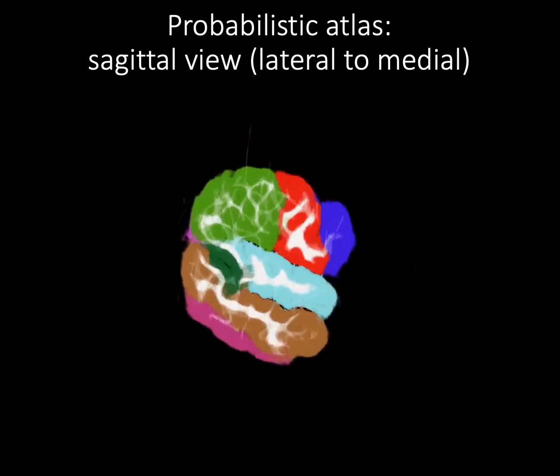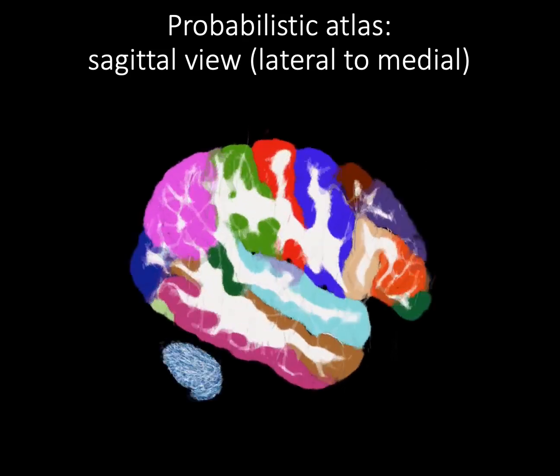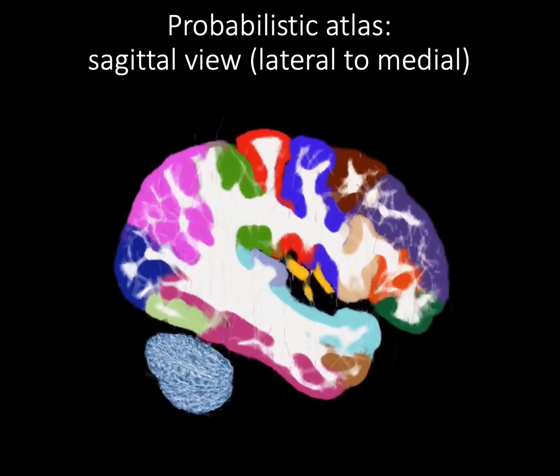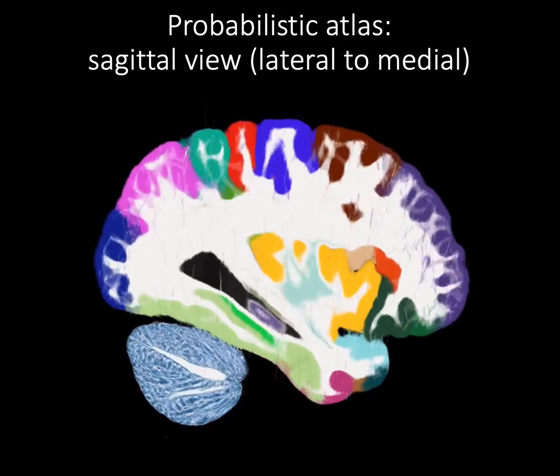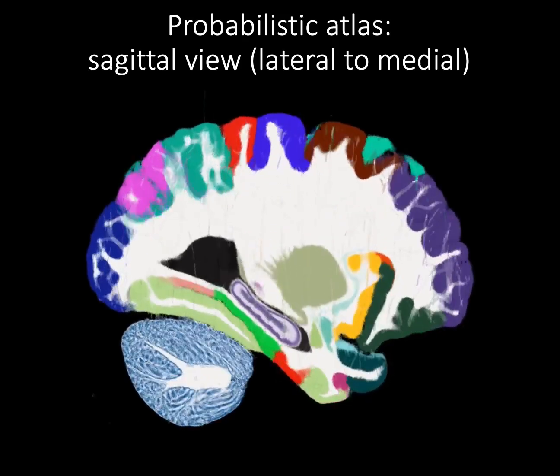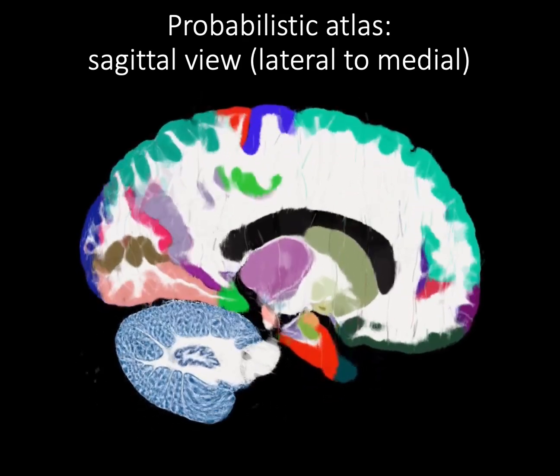This video shows sagittal slices of the atlas in lateral to medial order. We see the hippocampal regions in blue, the amygdala in green, and the thalamus in purple.